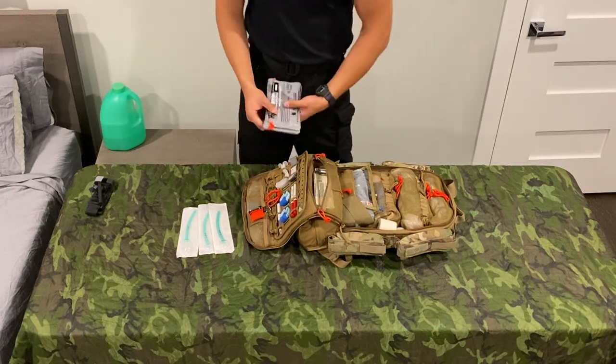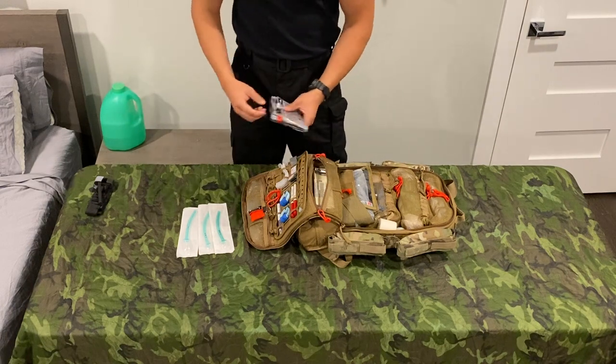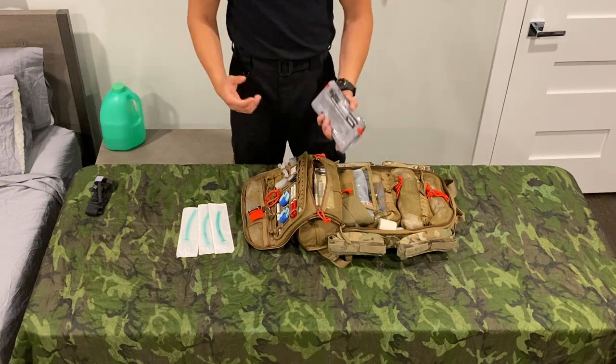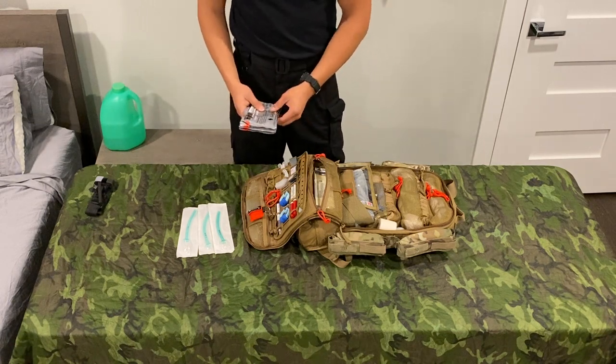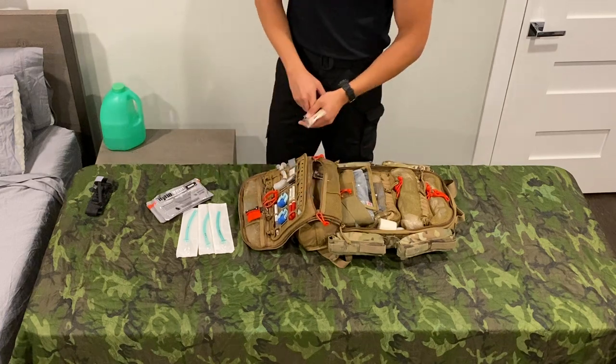With my occlusive dressings, which are Hyfin vents in twin packs — I have four here to supplement the rest of the stuff in my kit. I think Hyfins are pretty much the gold standard. The vents are nice and big, so they don't clog like the Ashermans or Bolin seals. The vented Halos are pretty good as well, but I'm definitely a Hyfin guy — they're also what we use at work.